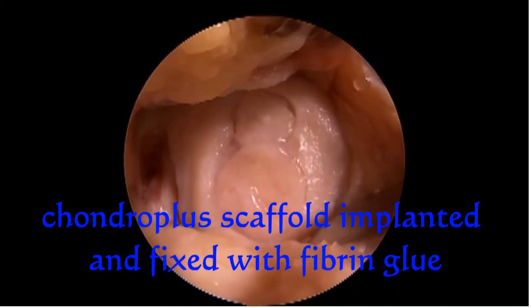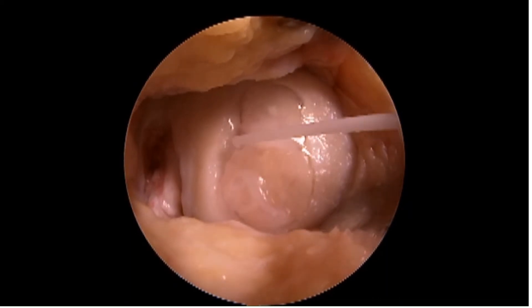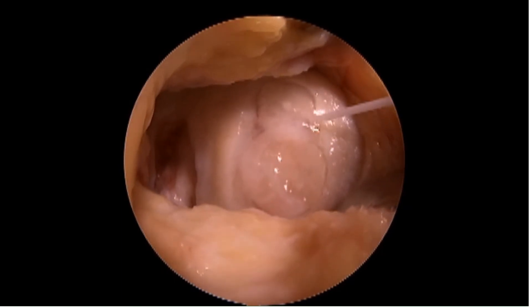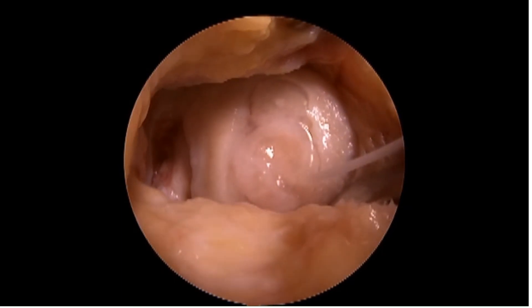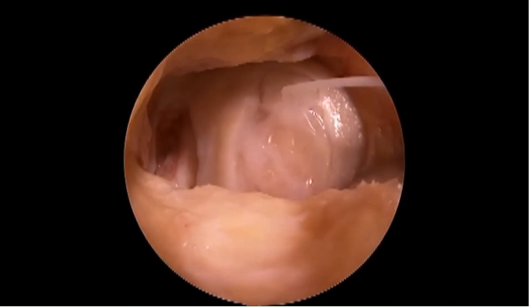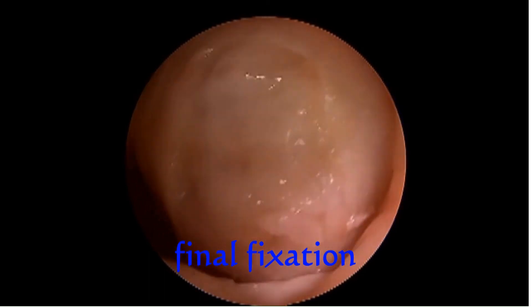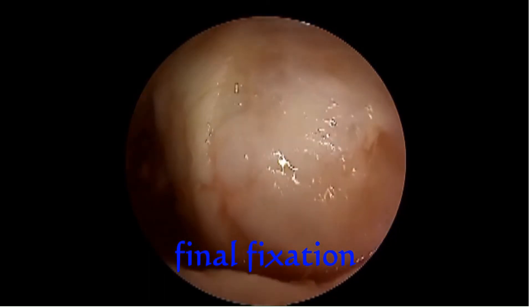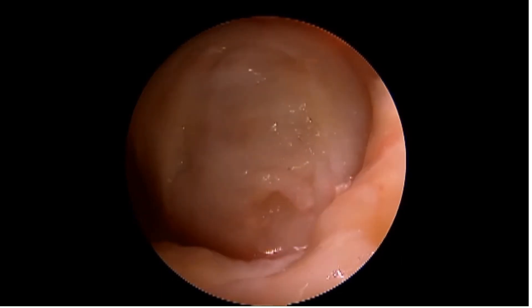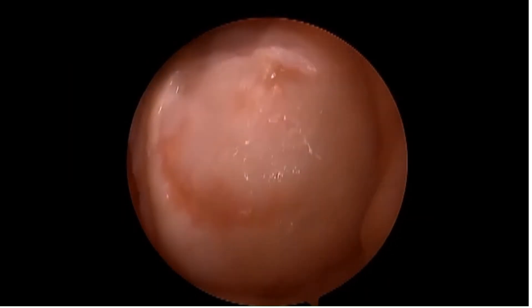After the Chondroplus scaffold was implanted, fixation with fibrin glue was performed. After fixation with fibrin glue, the final stability of the scaffold was checked. The scaffold was very stable and remained stable during range of motion.